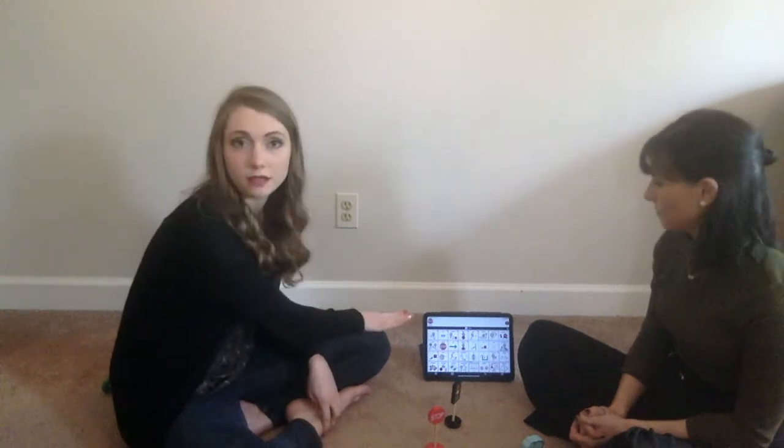Nice job, Alyssa. So this is how you can use the device even if you don't have a communication board to model. You model straight on the device and then you can have the student try. If the student doesn't want to try, that's totally fine because they're still getting the exposure from you practicing. And then later when they're ready to try, they will know how to do it because they've seen you.